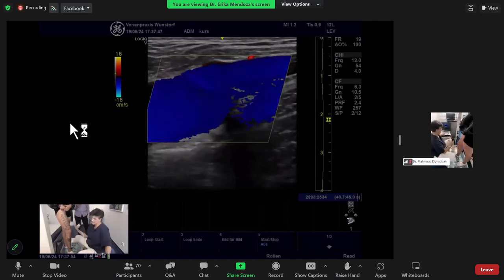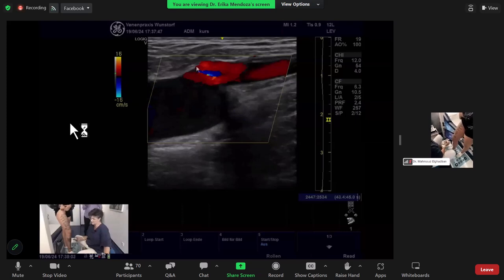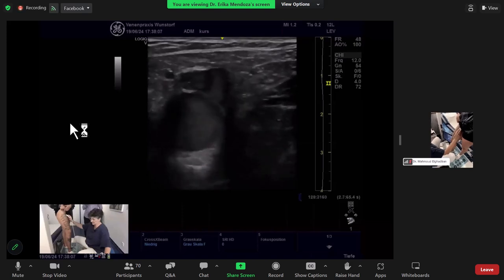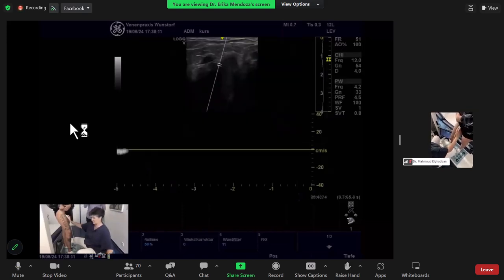Look, in the systole, it flows from the superficial to the deep. And in the diastole, it is not coming out from here. This means the terminal valve is competent, very obviously. And so we have to find where this reflux is coming from.